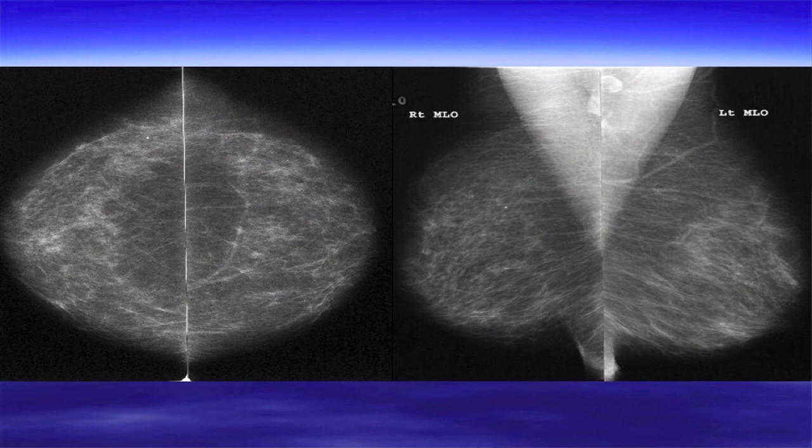So this is just to give you an example of what a mammogram looks like. MLO views, we're looking at the breast from an angle. There's the pectoralis muscle, and then CC views. This would be between a fatty and a scattered fibroglandular elements, because you can see the breast elements. The lines are those ligaments that we talked about. The lines are little ligaments, but the little nodular areas are just the glandular elements. And there's a nice round calcification. See right there? Calcification. Next.